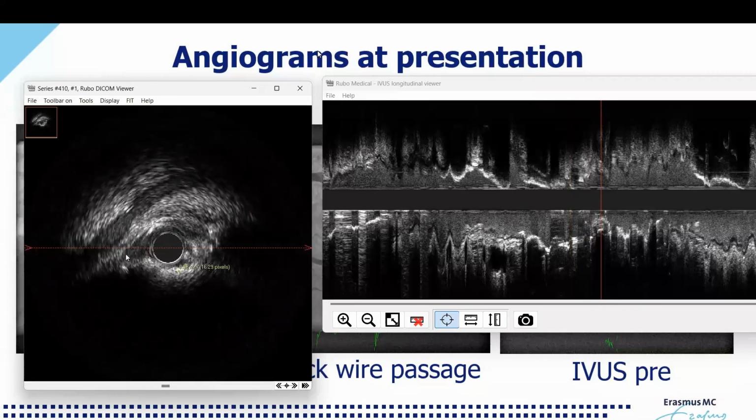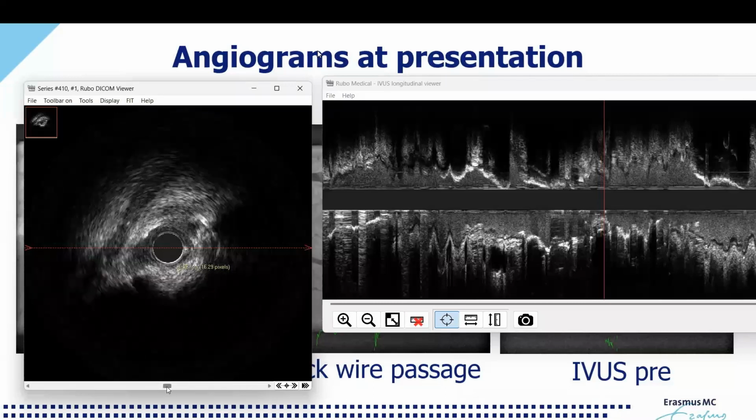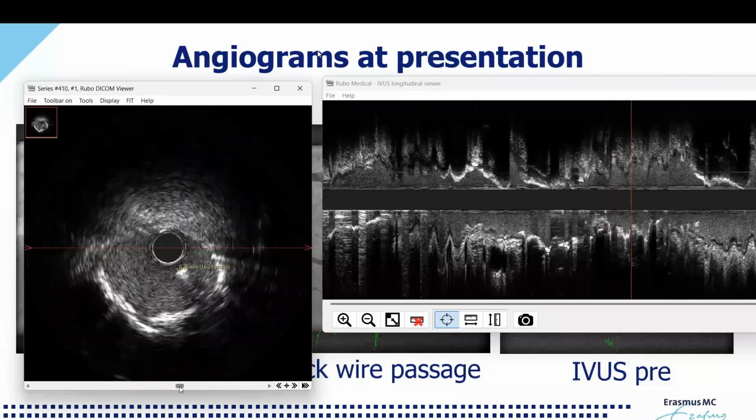And that means that your angiogram can trick you, because if your x-rays go from this direction, then you see the widest part of your contrast, and you will not be able to appreciate fully the stenosis on the angiograms. So we have here a completely underdeployed stent, and probably that was the cause for thrombosis.